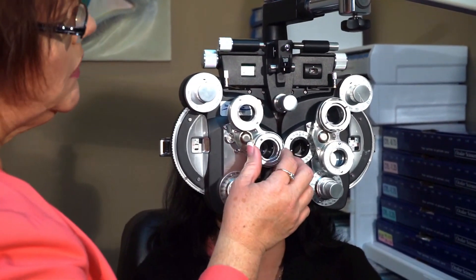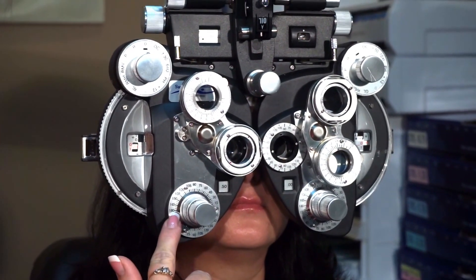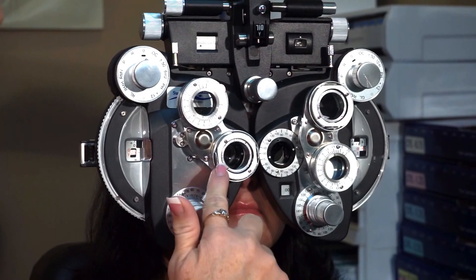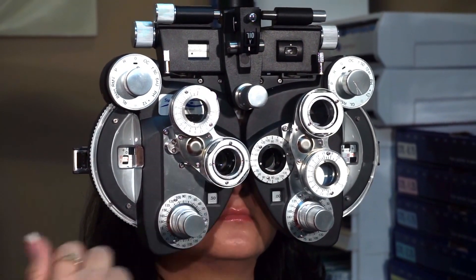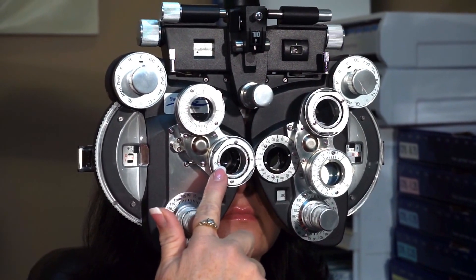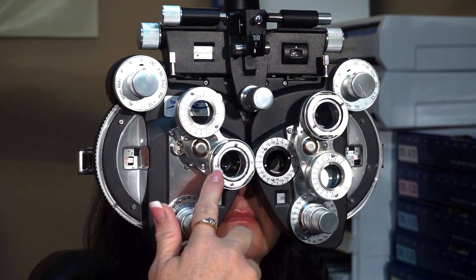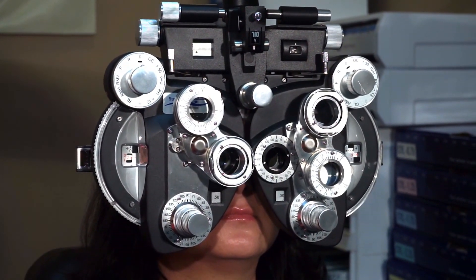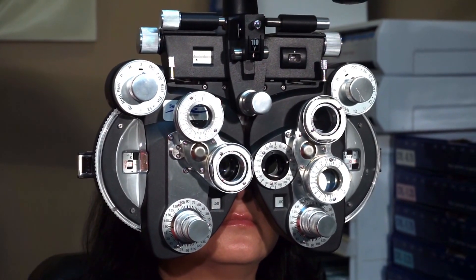So I'm going to bring my Jackson Cross Cylinder into position. There are only two positions that the JCC will click into. It will either click so that my red and white dot are straddling the axis — here's axis 180 — or it will click so that my red or white dot aligns with the axis. When the dot is aligned with the axis, we're checking cylinder power. There's a 'P' that reminds you: when the P is aligned with the axis, you're checking cylinder power. When the red and white dots are straddling the axis, you're checking axis. We check axis first, then cylinder power, because if we're offering cylinder power at the wrong axis, she won't accept the right amount.